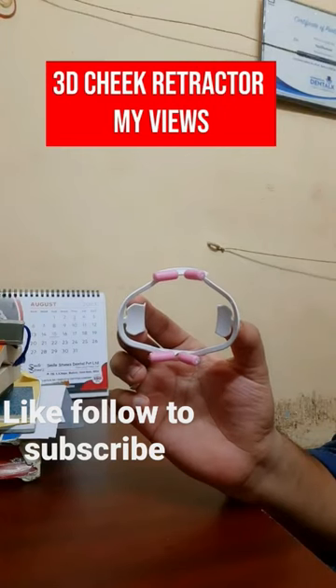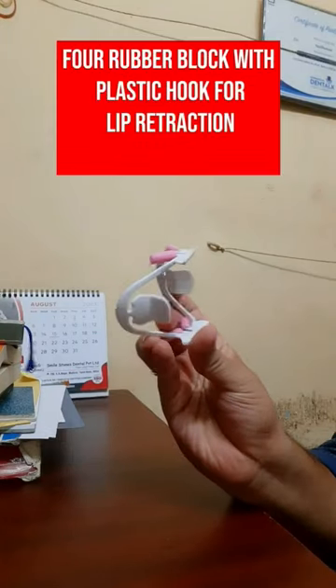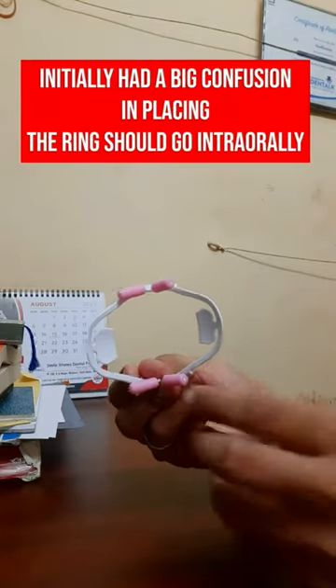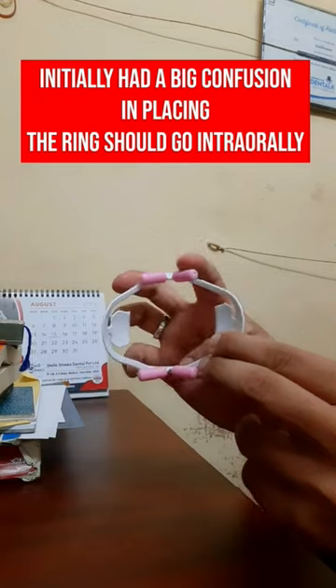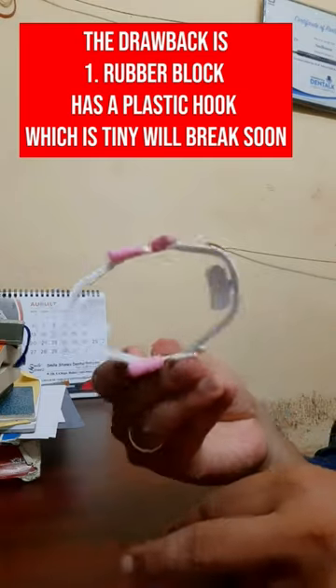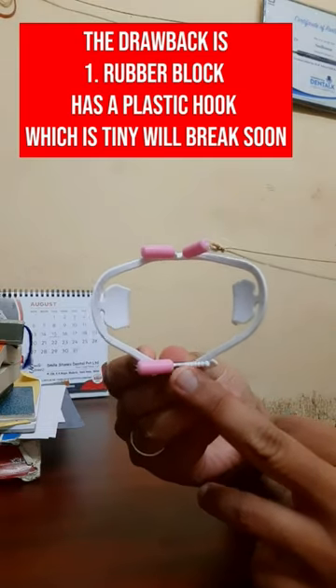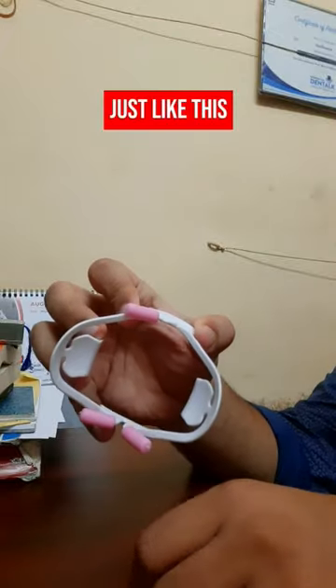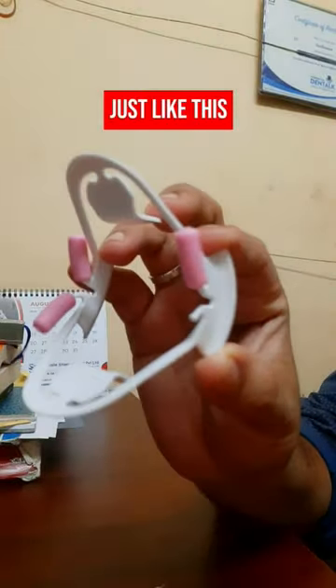My views on the 3D cheek retractor. You can see this device has a rubber block which hangs on a plastic hook for lip retraction. The wing should go intra-orally during placement. The rubber block that hangs on a plastic hook will easily break after using once or twice on a patient. You can see my 3D retractor — the plastic hook has been broken, just like this.